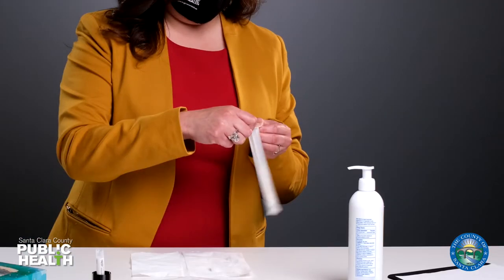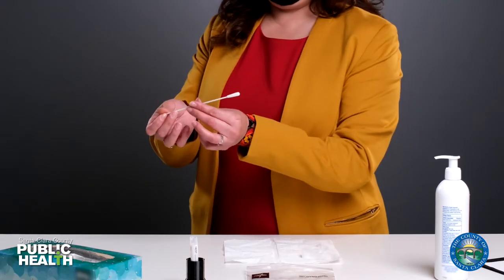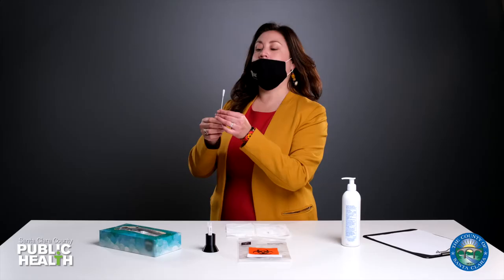Open the swab and throw the wrapper in the trash. Avoid touching the cotton swab to prevent contaminating it. Lower your mask below your nose while keeping your mouth covered.